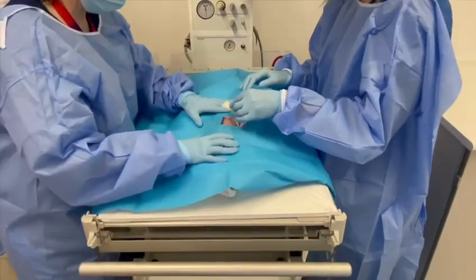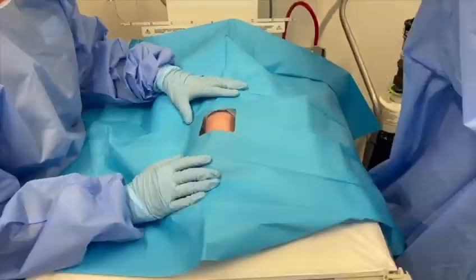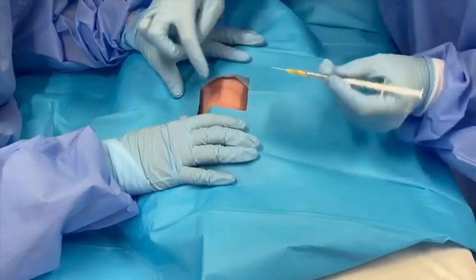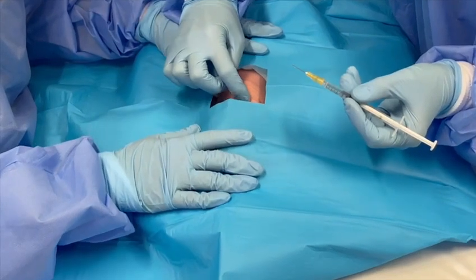Insertion of pigtail chest drain. Position the infant with the affected side uppermost and the arm extended above the head. Monitor the infant's heart rate and oxygen saturation levels throughout the procedure. Prepare the area with the antiseptic solution and drape.